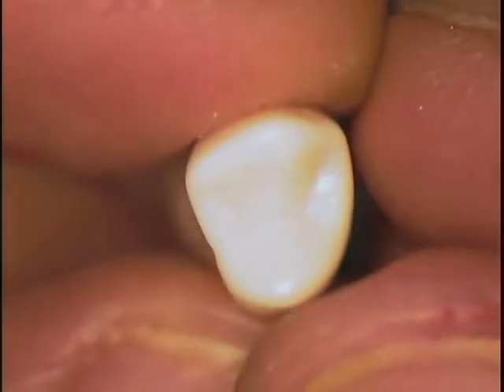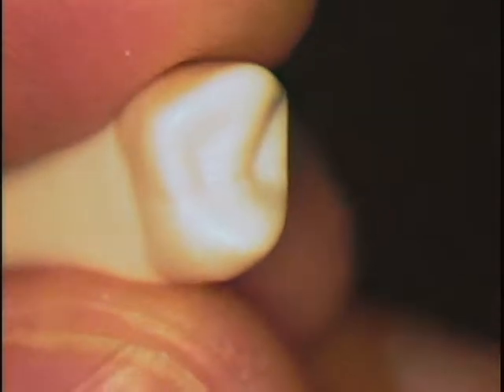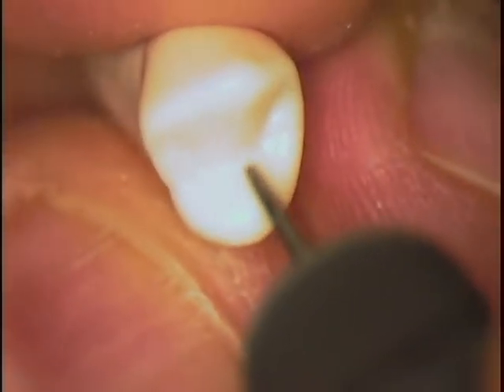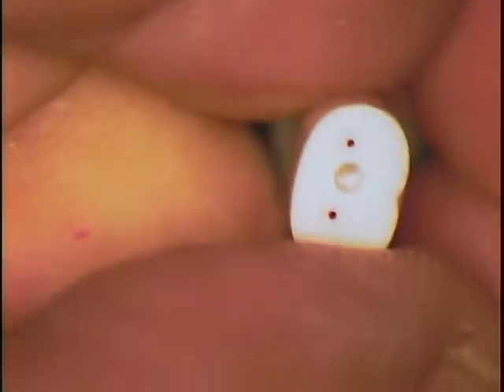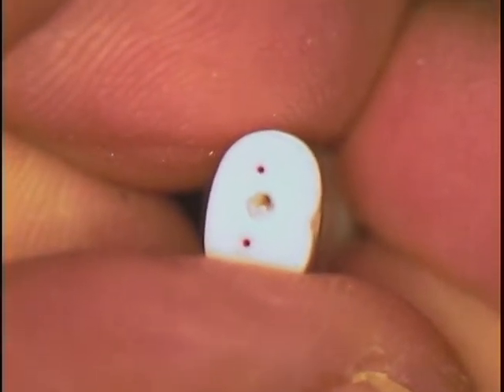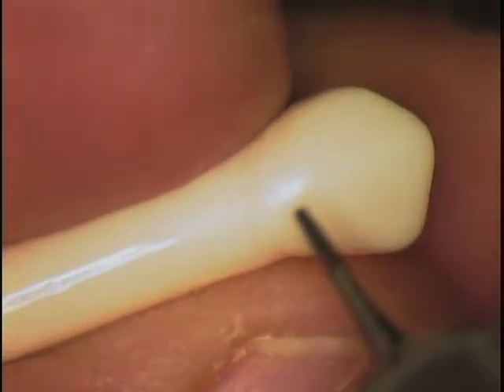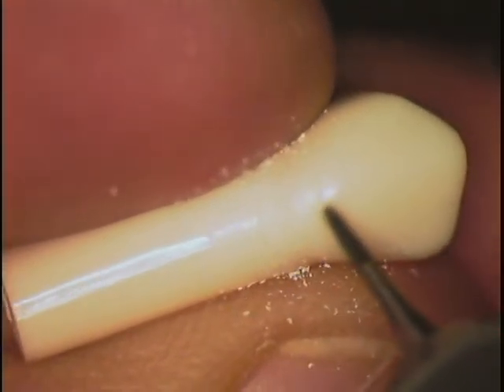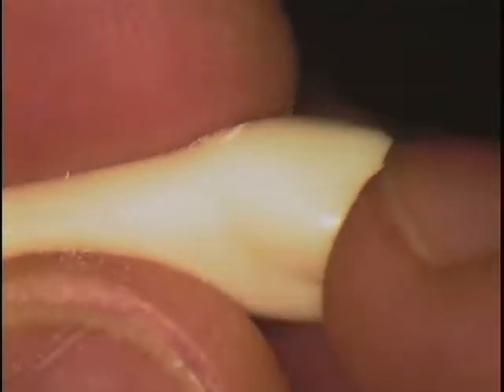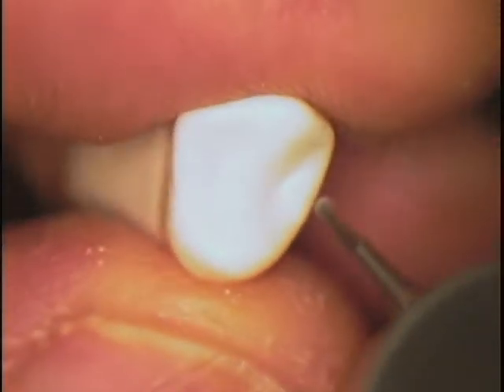So we're going to operate at a higher power now. I'm going to be up around, let's see, we're right about 8 power. So my axis is going to be right in the central groove area in the middle of the tooth. Let's make sure this is our endo-treated tooth. Okay, so you know you've got 2 canals. I did instruct the class that we're going to mark the buccal. I'll just put a little dot so I know that this is my buccal side of my tooth, just to mark it.